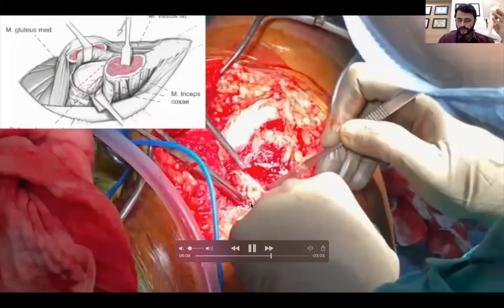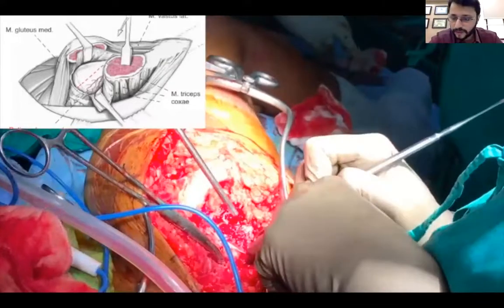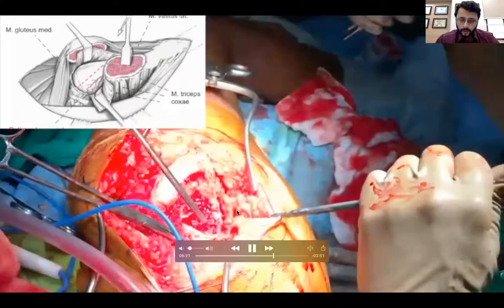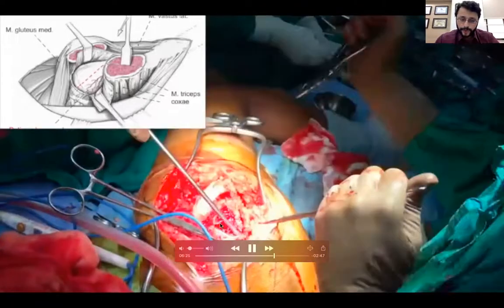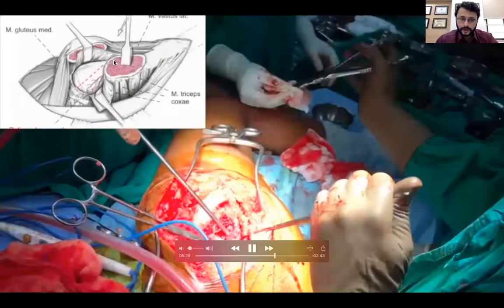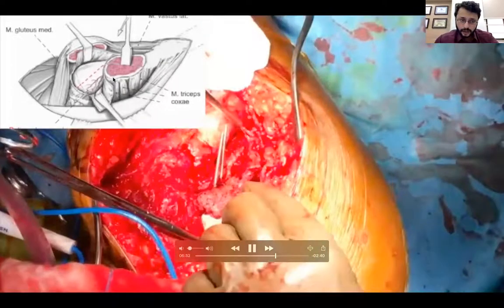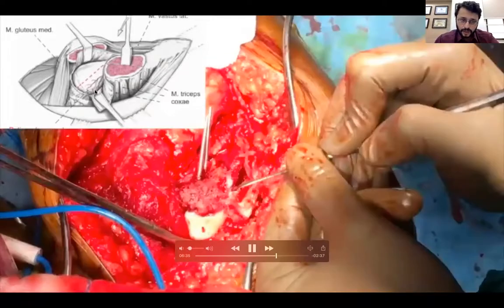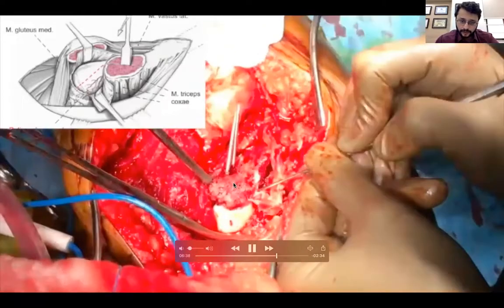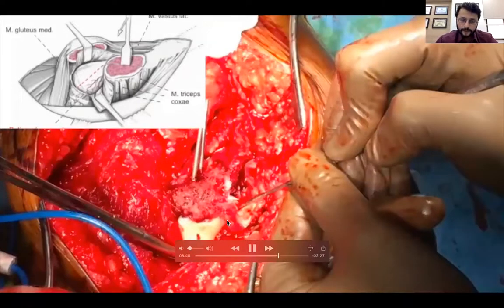This is a slow process. This is where my assistants get tired and bored and think of things at home. And at that time, slowly I'm going to denude all this bone from the supra-apophyseal portion of the trochanter, right? So this is the apophyseal scar. I'm going to remove everything off the trochanter so that this entire retinacular flap is free, so that this supply to the femoral head is completely intact. You can see this flap which is going towards the femoral head, right?